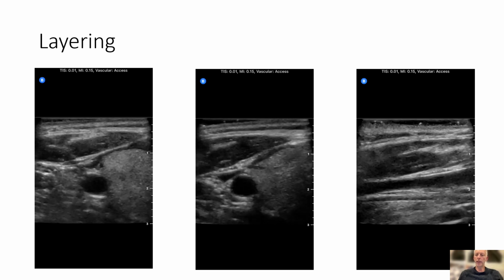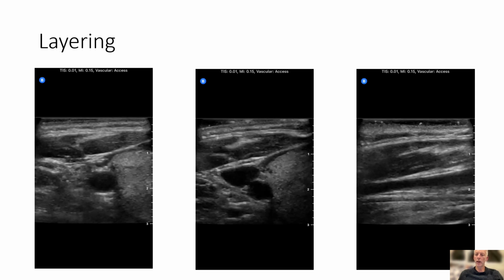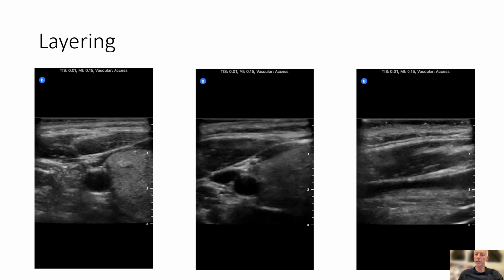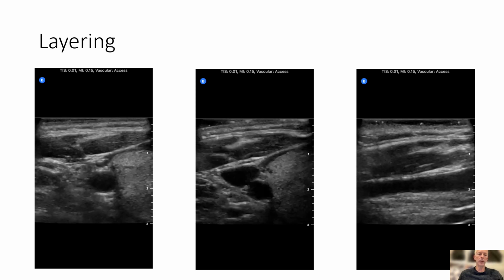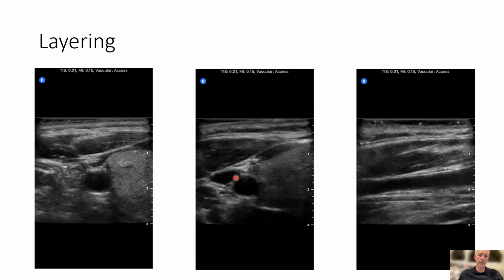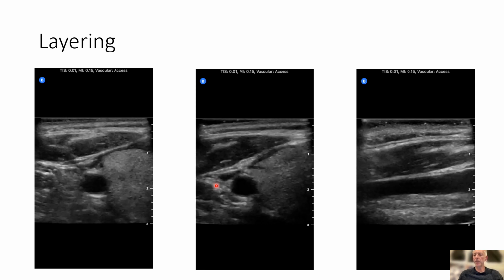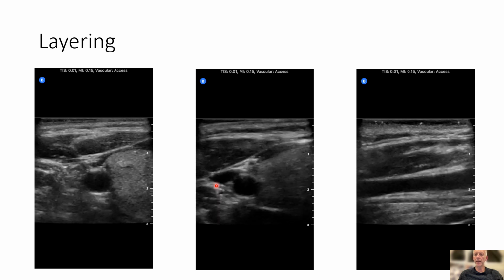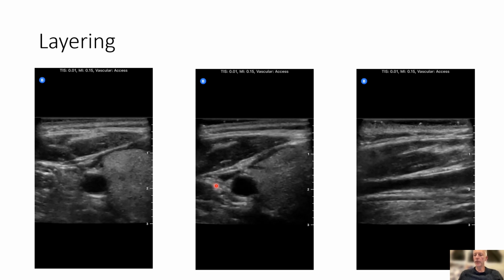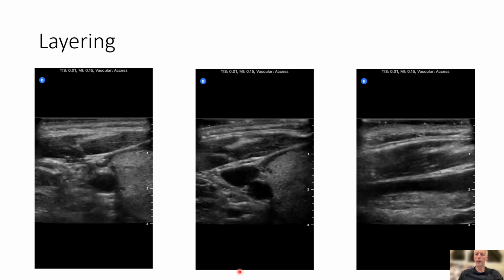The transducer begins at the level of the clavicle and then slides towards the angle of the jaw. There is fluid layering out in the vessel as return from the head increases and the IJ flattens out. The IJ can be seen here. However, it is clear that the size of the IJ is much less than that of the carotid, and there is no clear taper. This is layering, which is not the same as the pressure column that is related to jugular venous pressure.